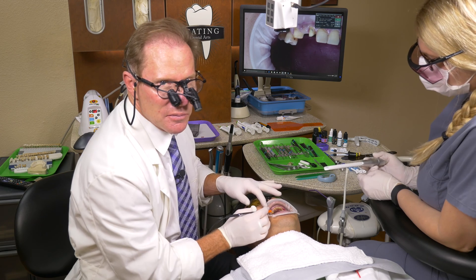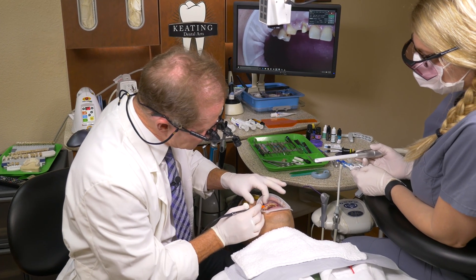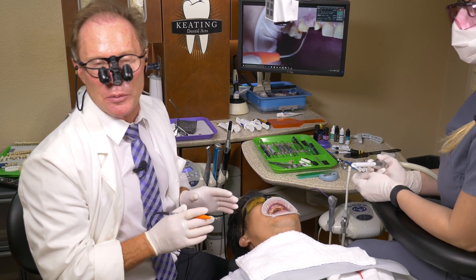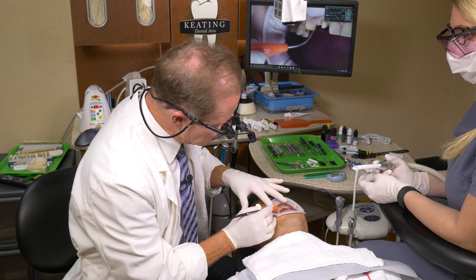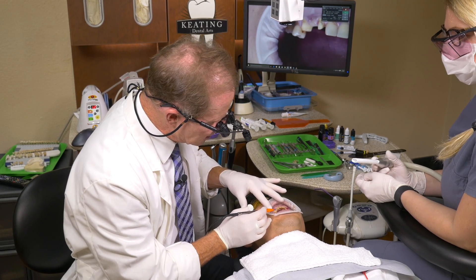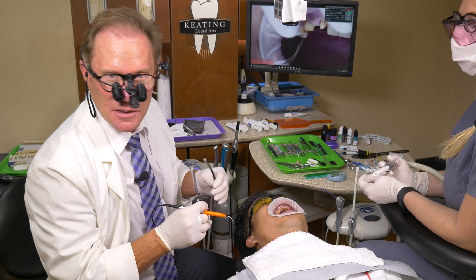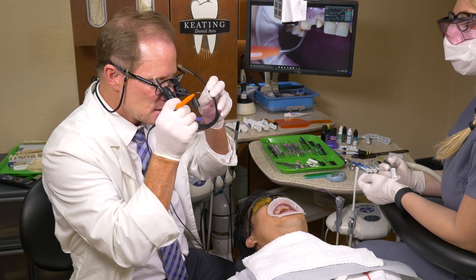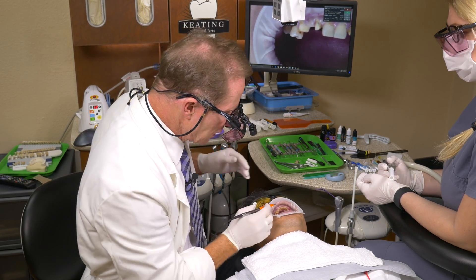You can see it's off there. Kenny is numb. The healing with the diode laser is exceptionally fast. His postoperative pain — in fact, the only postoperative pain he'll have — is from the injection sites. You can see the little hematomas from the injection sites here. With the diode, we do want to wear protective glasses. Kenny has protective glasses, Jessica has glasses, and since I have my loops on, I'm going to use these over my loops.